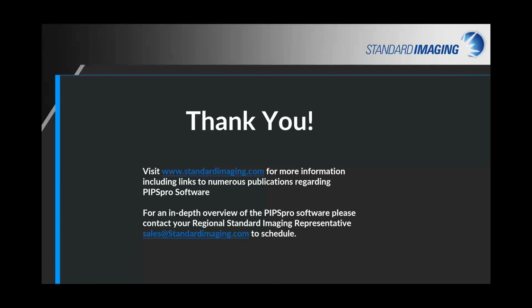So we keep building on it and improving it, with feedback from users, but also prospective users, who give us good ideas and good feedback on what to build upon and add to it. If you want more information and maybe want to look at some of the publications regarding PIPS Pro, they're all available on our website, standardimaging.com.